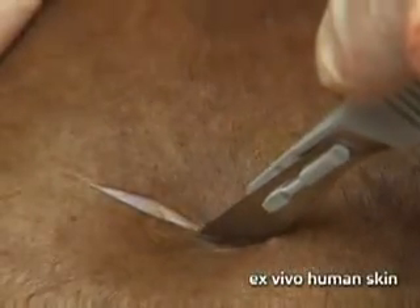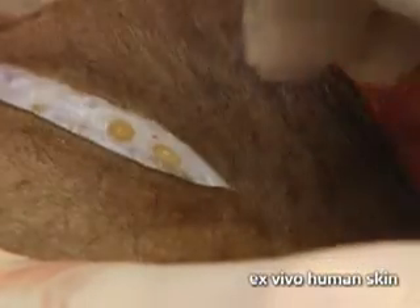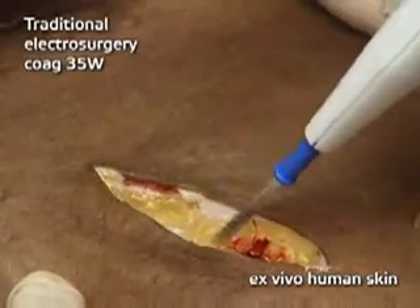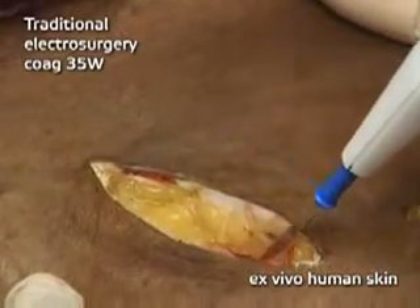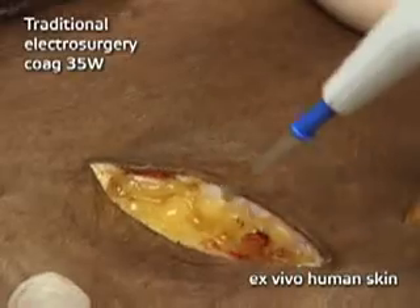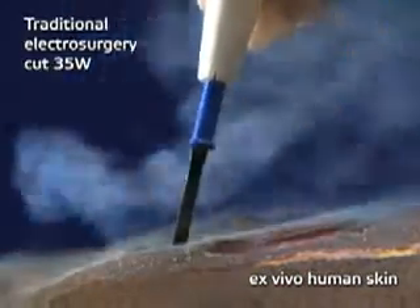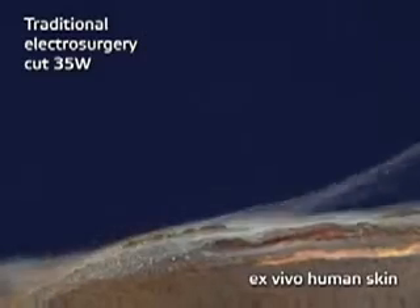Historically, surgeons have used a scalpel to cut the top layers of skin. Scalpels offer unsurpassed precision but are not designed to control bleeding. While using electrosurgical devices such as a bovie, surgeons were able to coagulate as they cut through deeper tissue structures. But unbridled energy and extremely high heat resulted in uncontrollable vaporization of tissue and charring of the surrounding cells, leaving dead and damaged tissue that may compromise efficient healing.